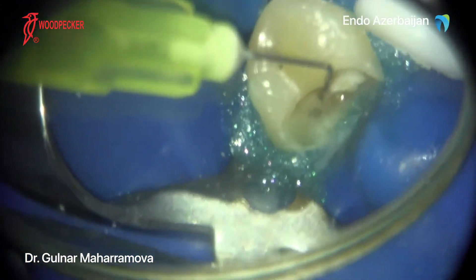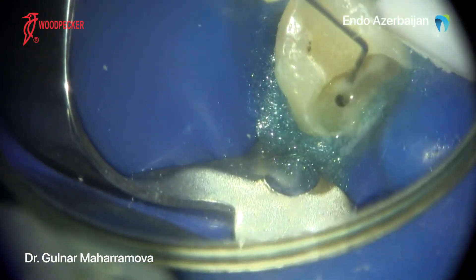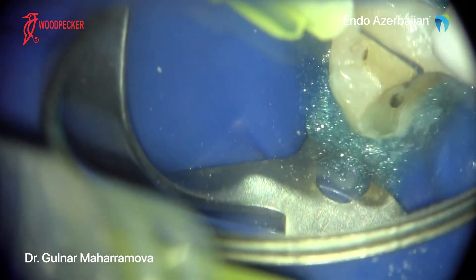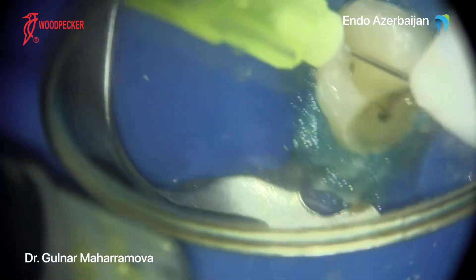Within minutes, I was able to complete the shaping and the final irrigation of the root canal. Laser energy was used to activate the solution of sodium hypochlorite.